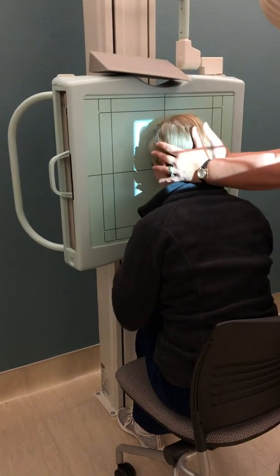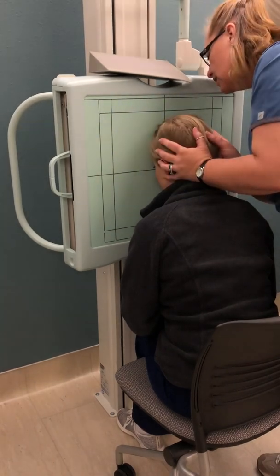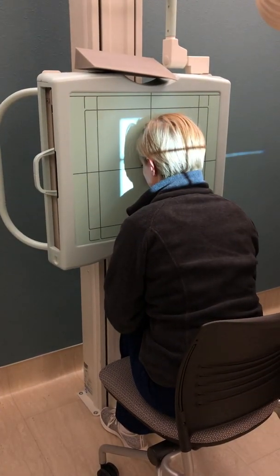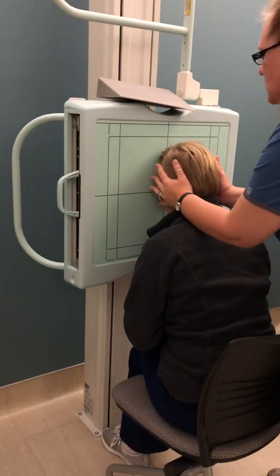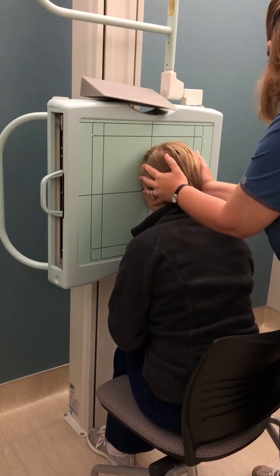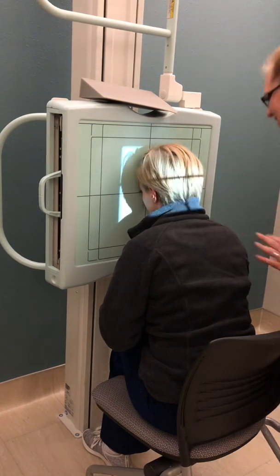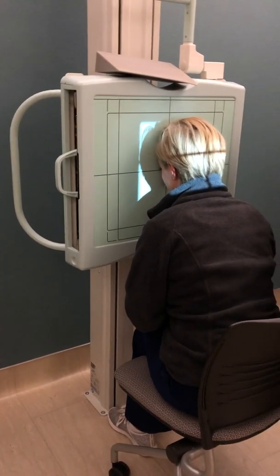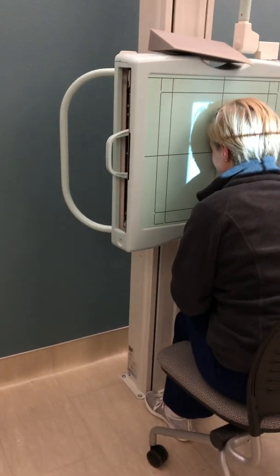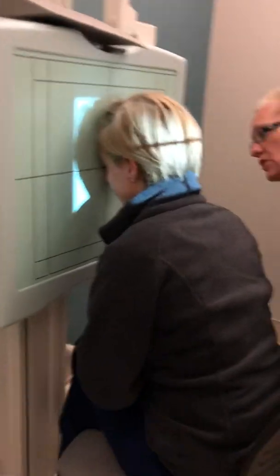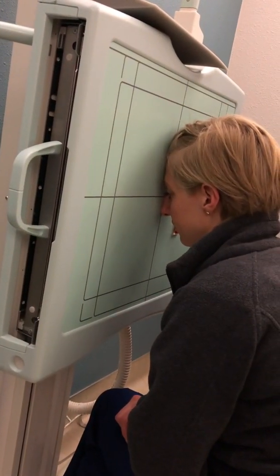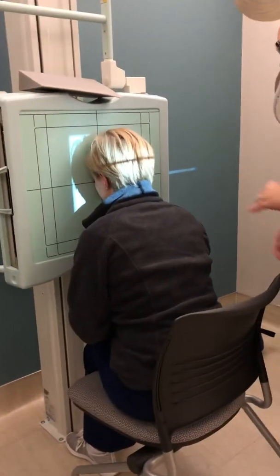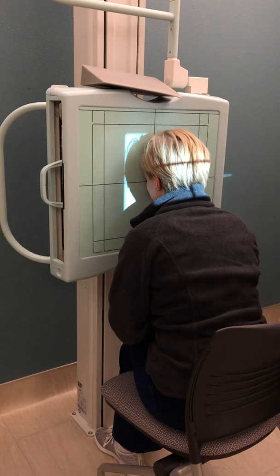You can't go by the hair — you have to feel. I have to look at her nose to make sure she's centered, because this position feels completely unnatural. Make sure that everything is straight, but until you put your hands on, you can't tell because hair can do all kinds of things. We want the OML to be perpendicular, which she has accomplished. Look at that orbitomeatal line — perpendicular to the IR. We're exiting through the nasion at a 15 degrees caudal angle.